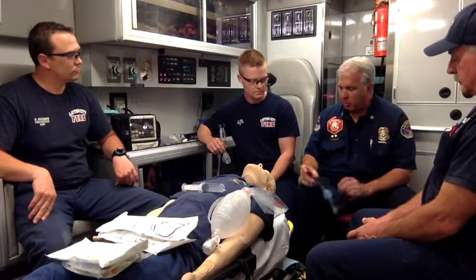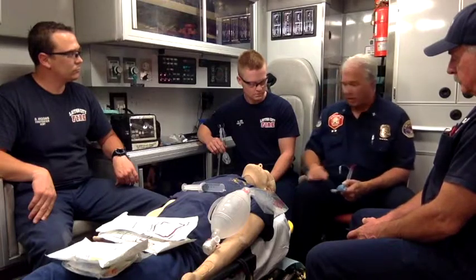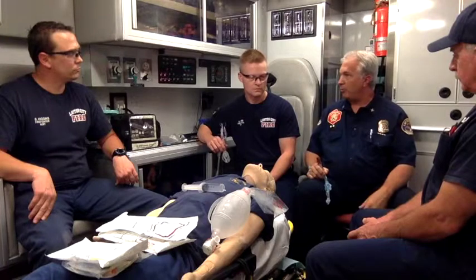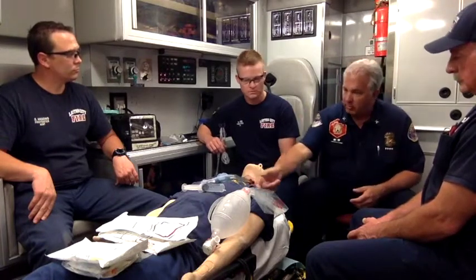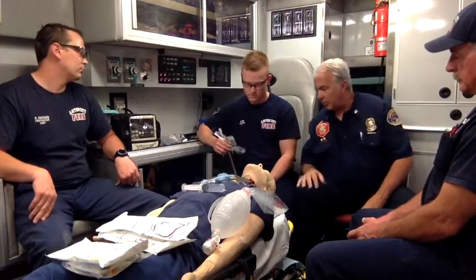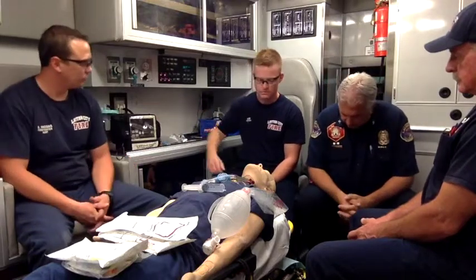This is your suction port. But you'd railroad that bougie through there to come out, in theory, right in front of the glottis. The bougie'd go in and then you'd pull this out. Well, the problem was you were pulling the bougie out with it. And so now the manufacturer no longer recommends that you do that. The cool part about this one is that we can do that. So after we demo that, we'll talk about this. So we've got a few different options available for us, right?